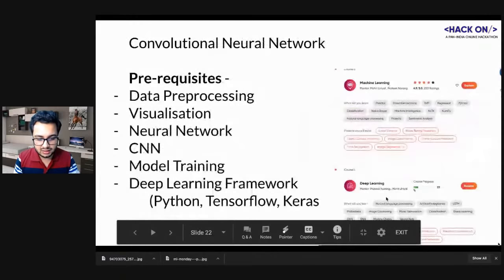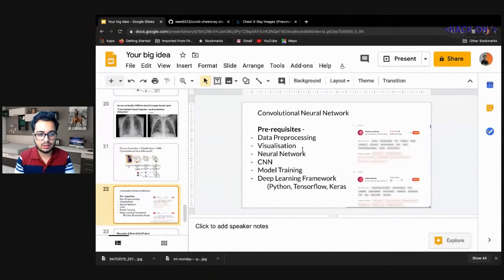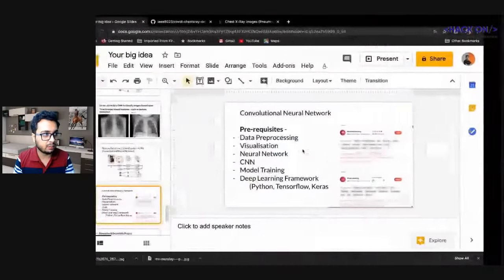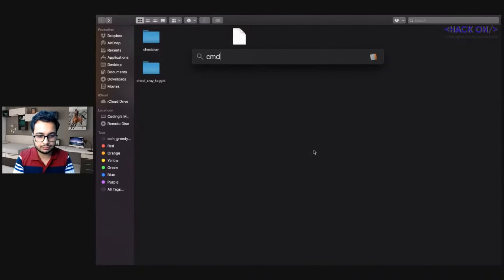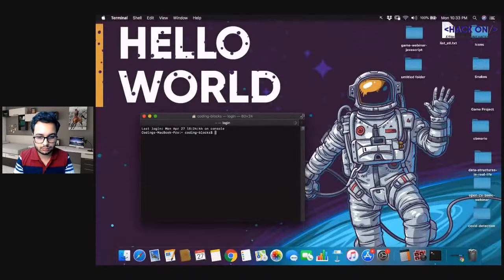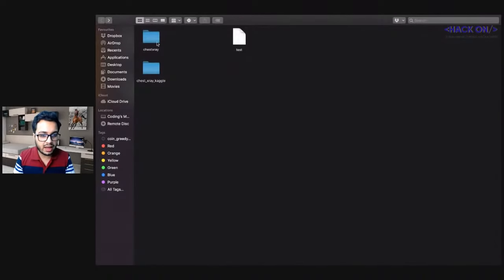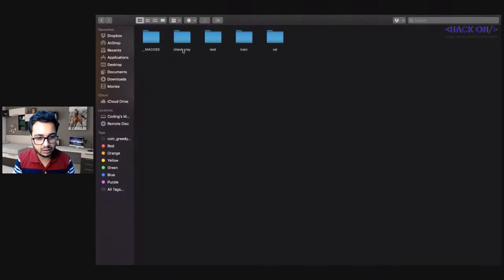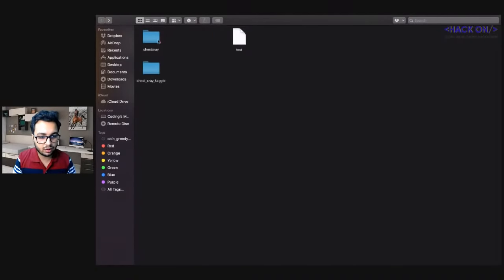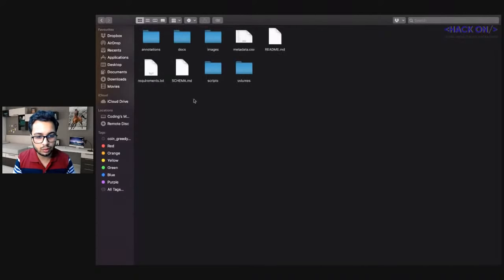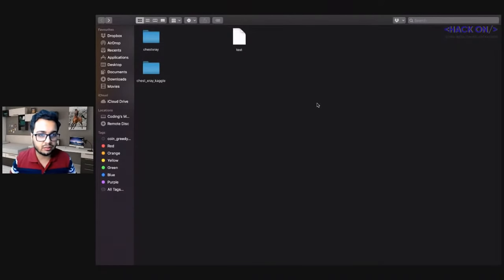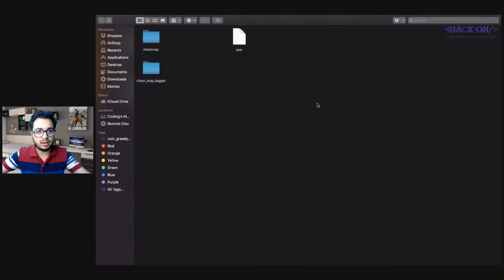Let's get into the coding part. I've already downloaded two dataset folders — one is the chest X-ray dataset from Kaggle and another is from GitHub. We'll first write a script to help us generate the data.